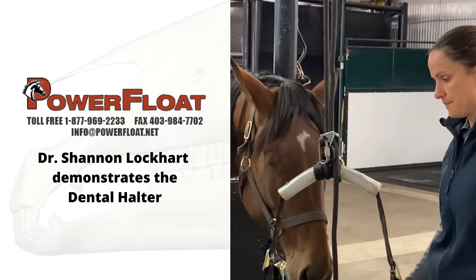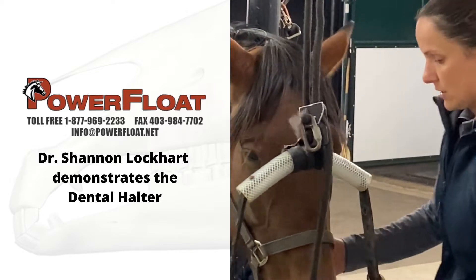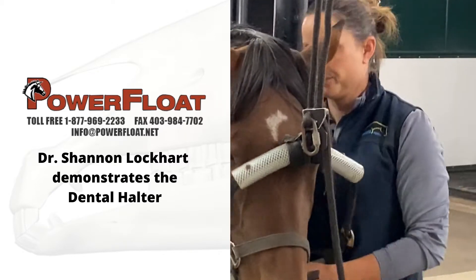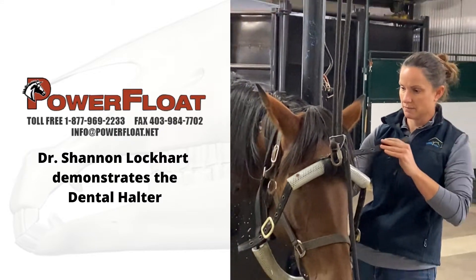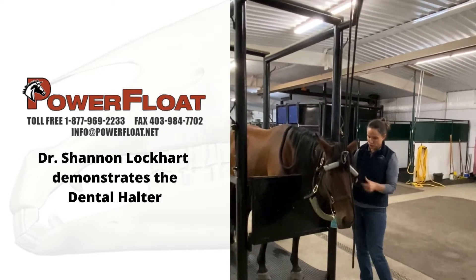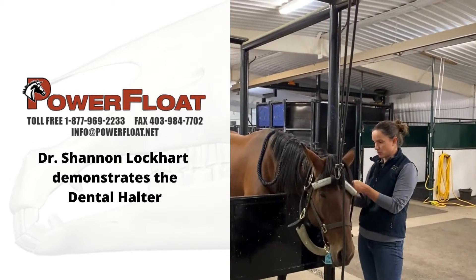So that's all you need to do. Once you have your speculum in the horse's mouth, all I do is pop it under. If you're doing a regular halter, you don't want it too tight. You want the bottom of the halter to be under the chin of the horse — very important to be able to support the head properly.